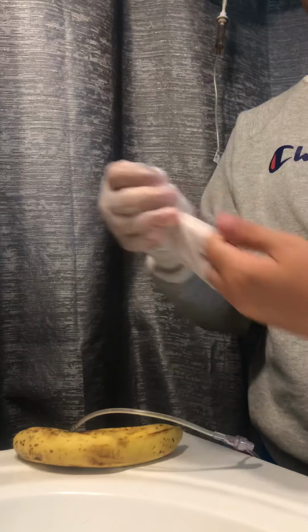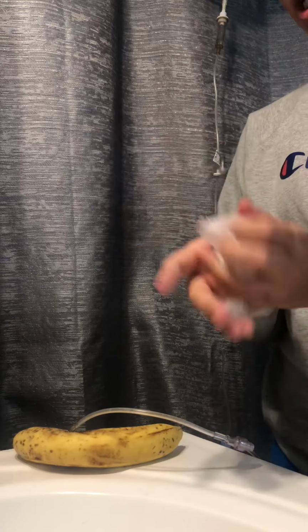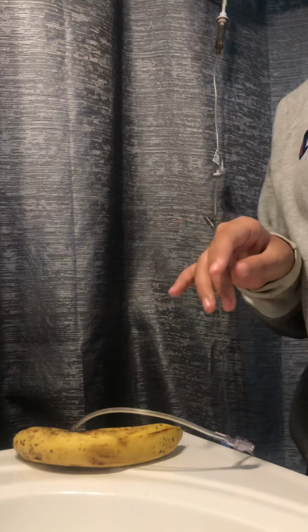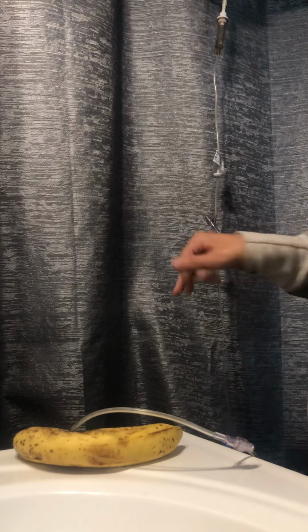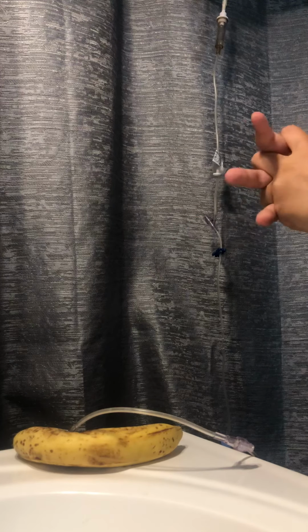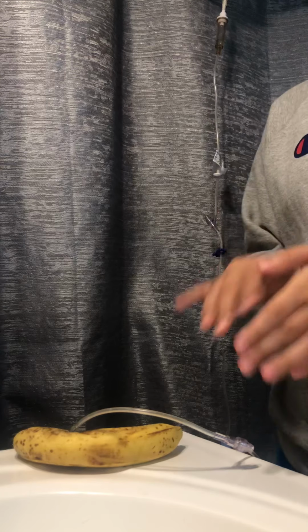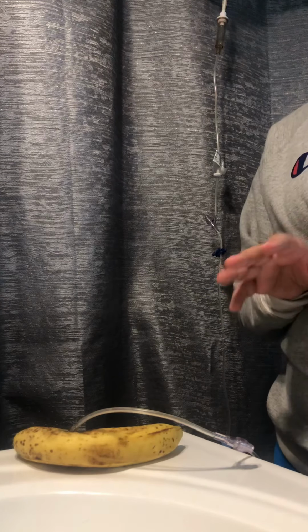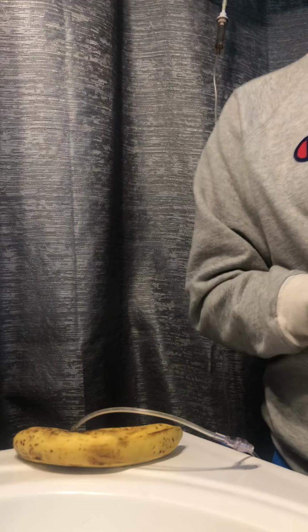Okay. We're going to take our gloves off and wash our hands. Check the site. The site looks good again. We watched the site the whole time. We are going to put our machine back on at 80 milliliters per hour. We're going to document, ask the patient if they need anything, clean up our area, hand them the call light, push the bed down, and we're finished.